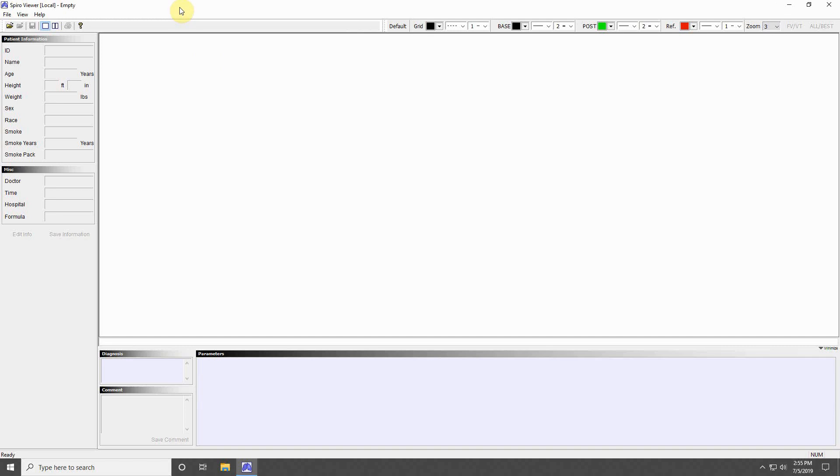The largest change you will note is that the Spiro Viewer program does not live monitor results from your machine. The program is only designed to display and analyze previously recorded data from your machine over USB transfer or internet connection. Let's take a tour of the program.